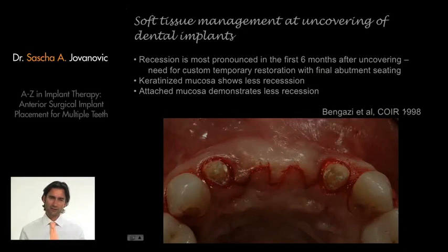So our incisions will always come more from the palate and be pushed over to the buccal, so swing to the buccal, so we can create thickness. Here in this particular case, the patient was treated with 2 implants, replacing 2 central incisors. And you can see here how I have created a design of my soft tissue uncovering, which is maintaining these principles, these criteria.